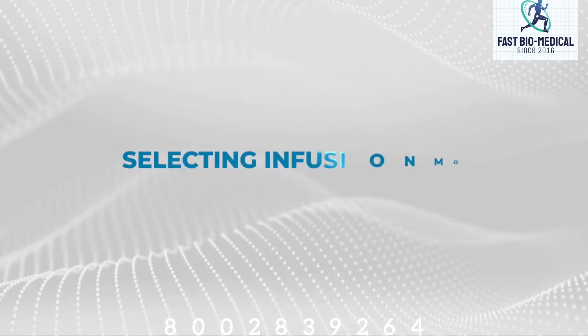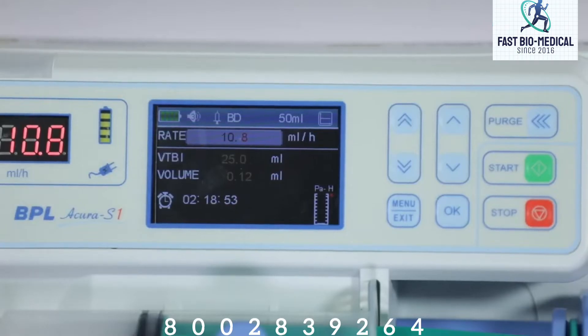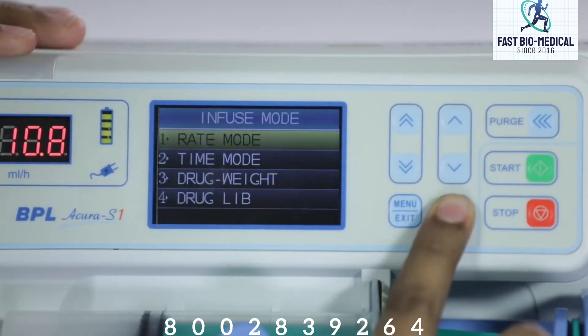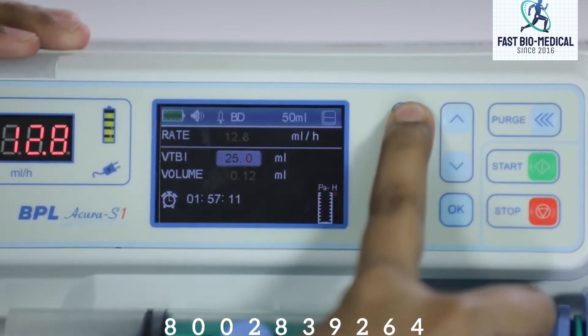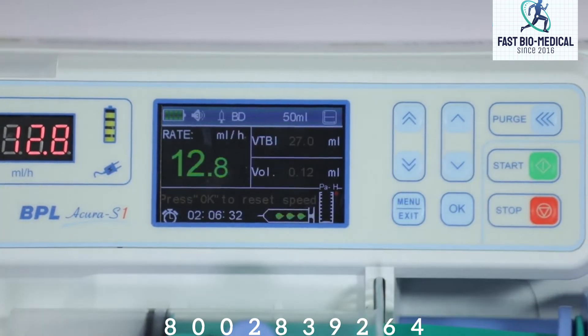Selecting infusion mode: the default injection mode of this pump is flow rate mode. You can choose other injection modes in this menu. The default running mode is flow rate mode — you can press OK to select and confirm the parameters.